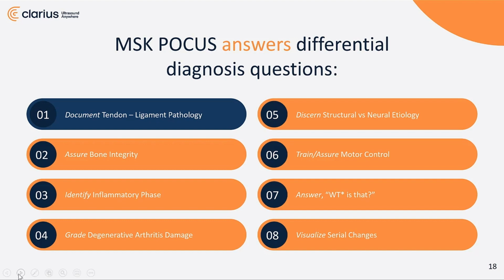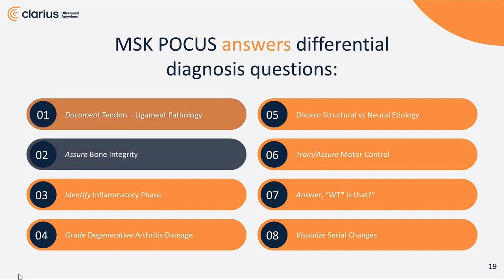After this good example of how ultrasound can be used to identify pathology in support structures, I want to move on in the next case study, demonstrating how we can use this tool to identify bony integrity.